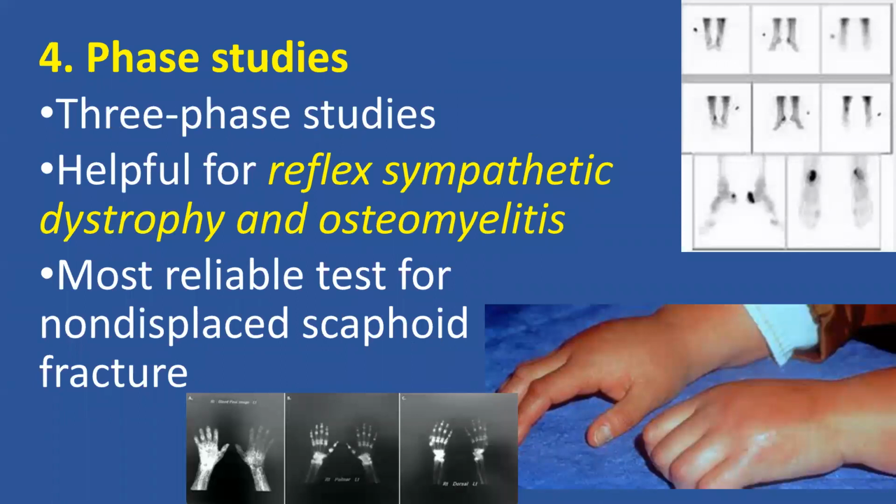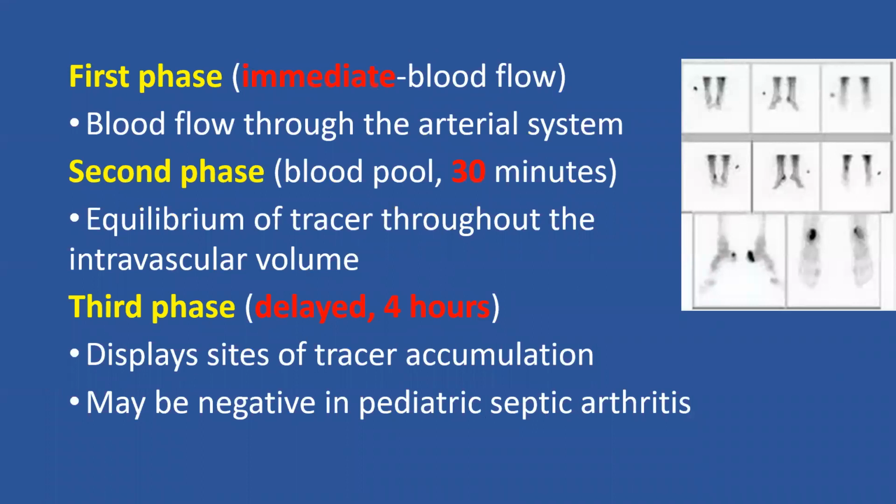What are the phase studies? The 3 phase studies, you should know them. And they help us also in reflex sympathetic dystrophy and osteomyelitis. The most reliable test is for non-displaced fractures of the scaphoid. What is the 3 phase study?